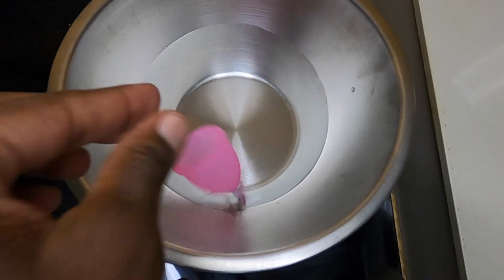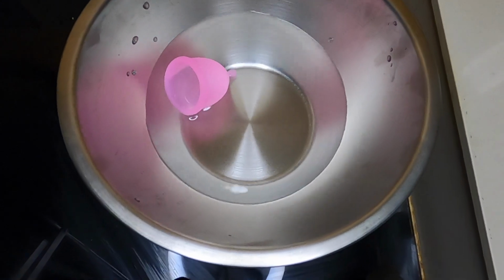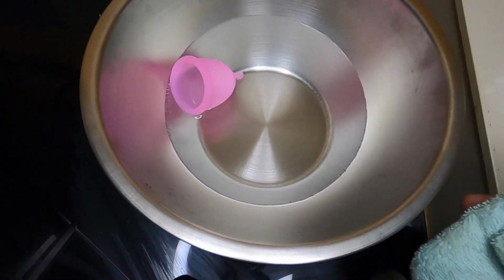So what they say is you have to boil it first for 2 minutes before you use it. Then after, you can insert it. Yeah, so let's do that. Okay, right now it's boiling, and I'm going to boil it for only 2 minutes, and then that's it. Please keep watching.